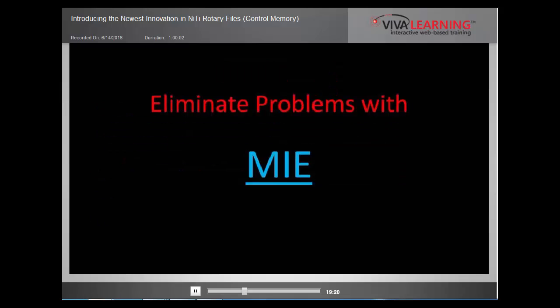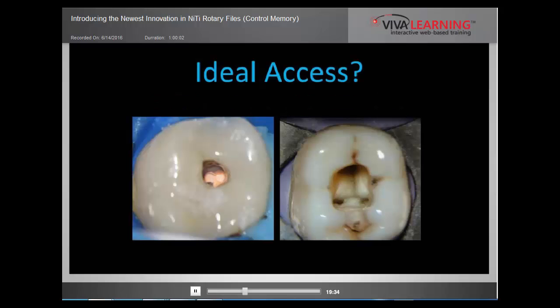So an easy way to avoid a lot of these issues is by the use of a very popular term now called minimally invasive dentistry or minimally invasive endodontics. Again, prevention, prevention, prevention. So here we have, on the right, the traditional access that we were all taught in dental school. They were taught that you have to see every single orifice when you're looking down on the canal.